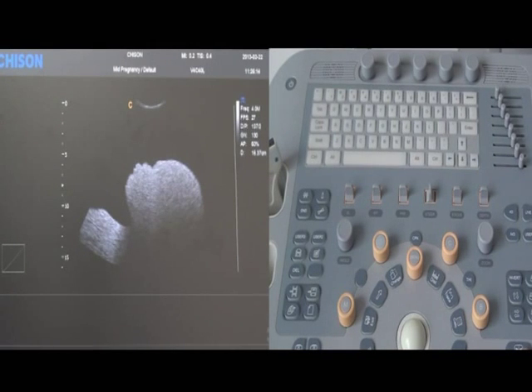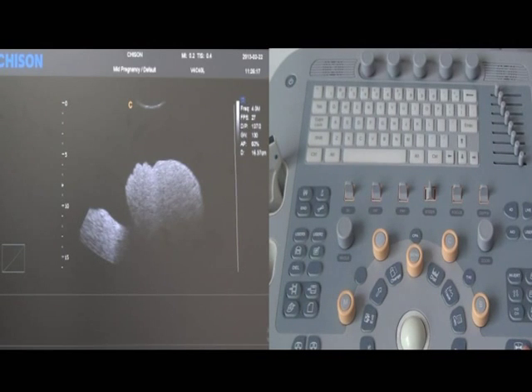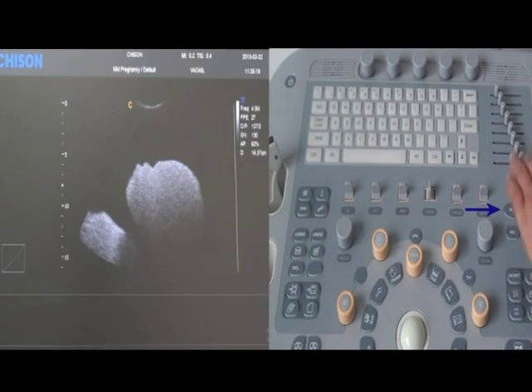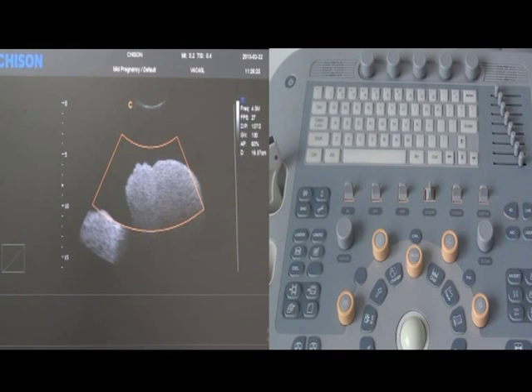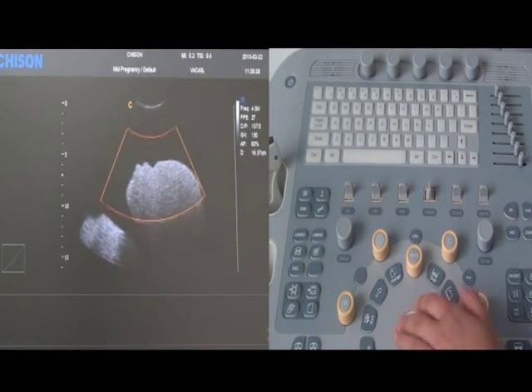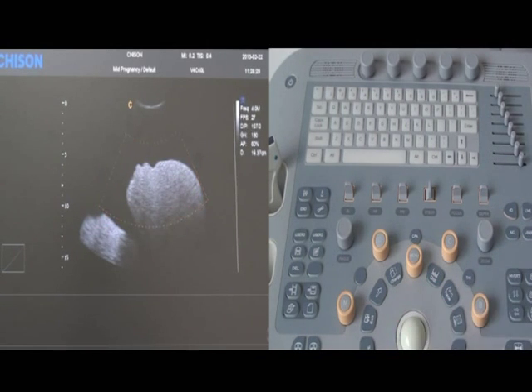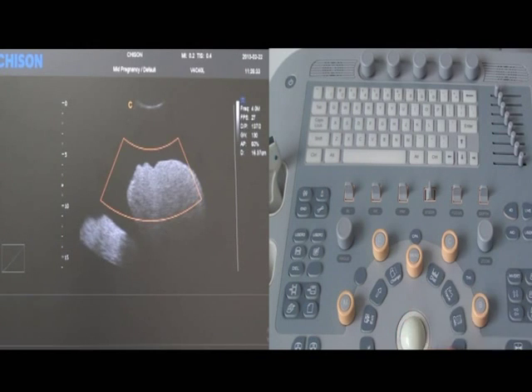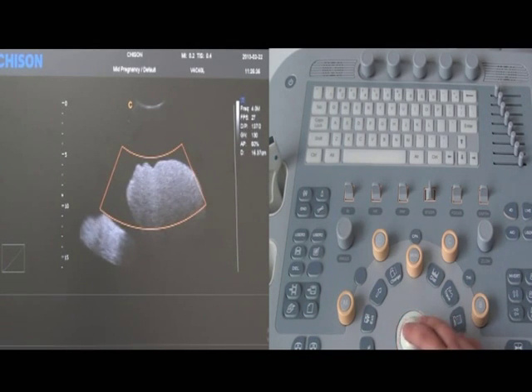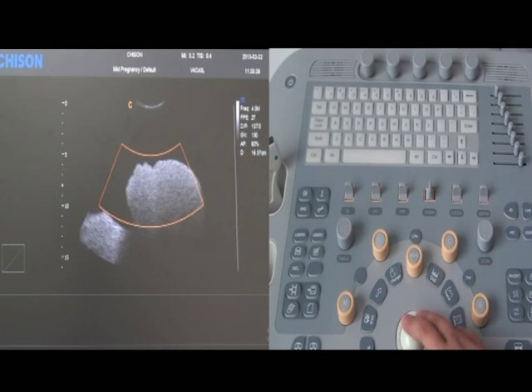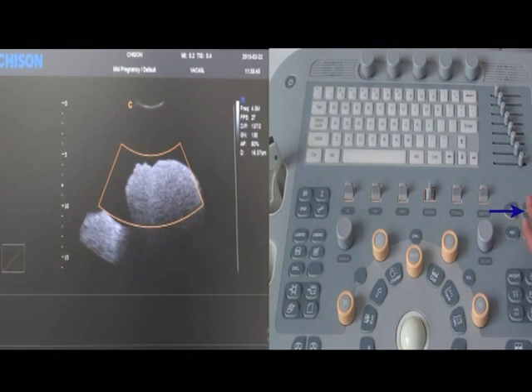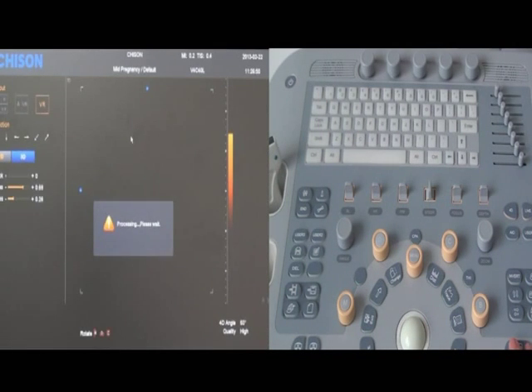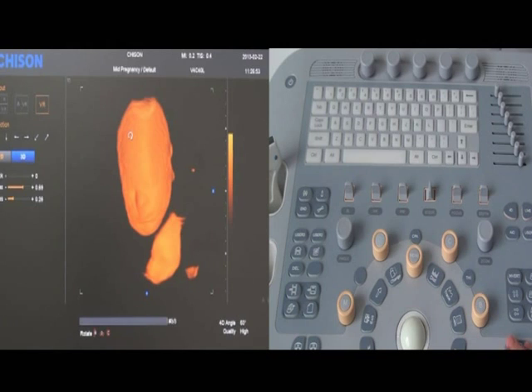After getting the sagittal plane, hold the probe and press the 4D key. The region of interest box will appear. Use the enter key and trackball to adjust the size of the box and move it to the right position. The size of the box should be appropriate — not too small, not too large. Move it to contain the entire fetus head. Then press the live key to enter into 4D mode. Press the freeze key. Now you have the 4D image.